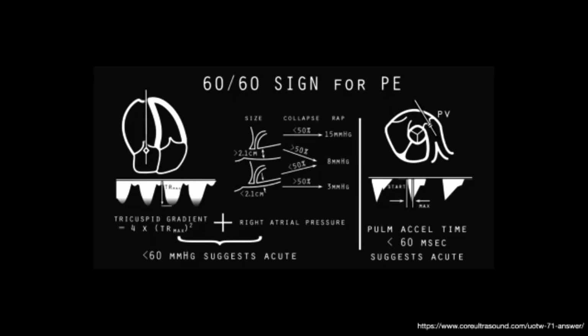Sure. The other question I have is, if someone who's previously healthy has a PE, this works. In fact, I haven't talked about the evidence for this, but for submassive and massive PEs, the sensitivity is about 51% and specificity about 96%, which is actually pretty good on the specificity side. And for the segmental ones, sensitivity drops down to something really meaningless, but specificity is still retained at about 94%. So for someone who's got a normal echo beforehand, obviously it's going to work pretty well.